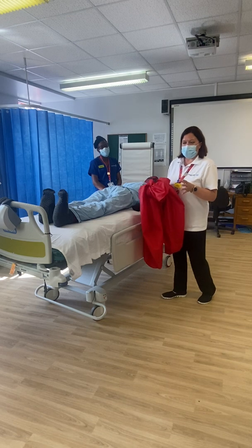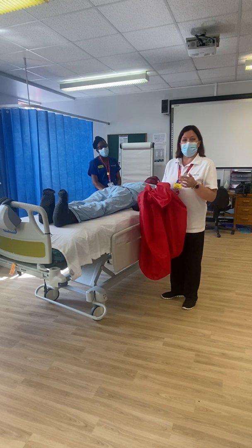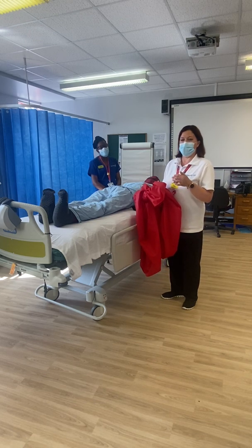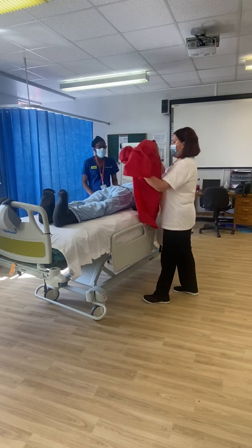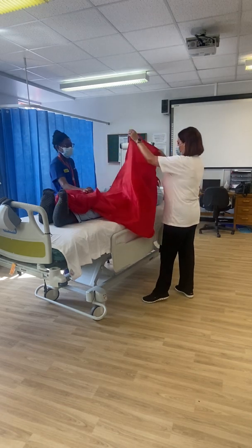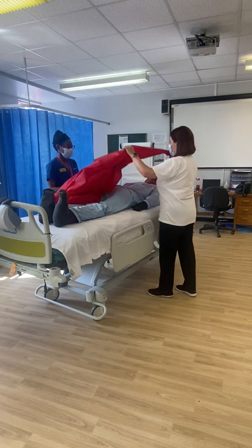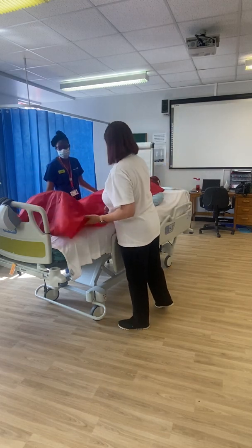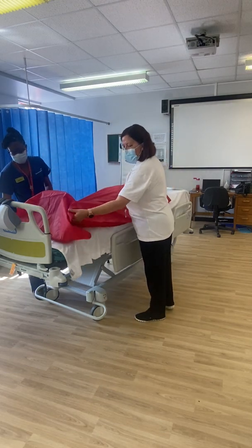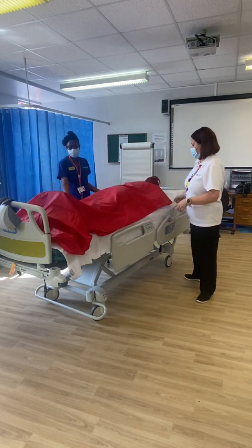If you have a really, really large patient or someone that is unable to roll for whatever reason, it's going to be really difficult to put the slide sheet in that way. So we're now going to show a technique called the unravelling method. So if your patient can tolerate it, have the slide sheet on top of them.